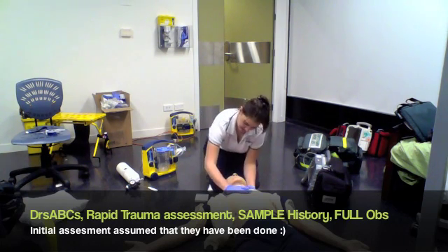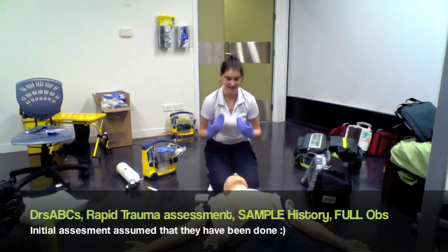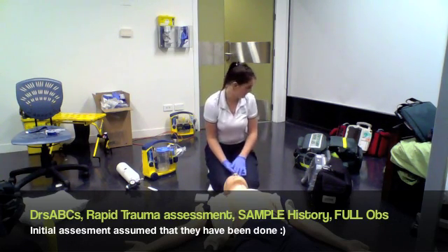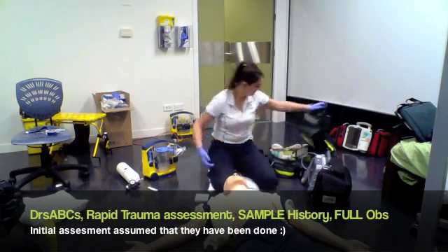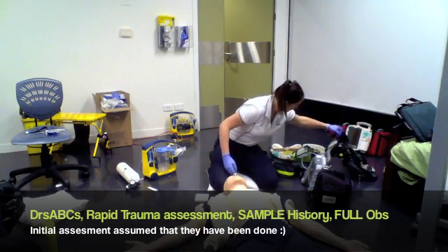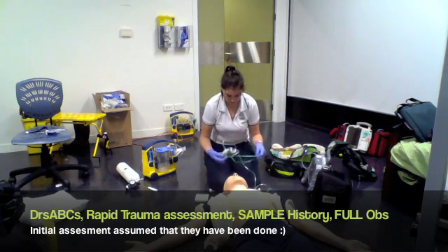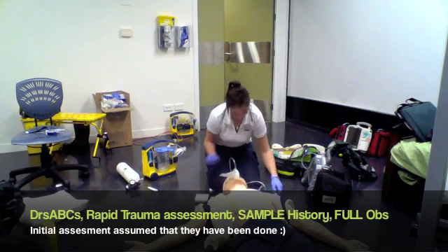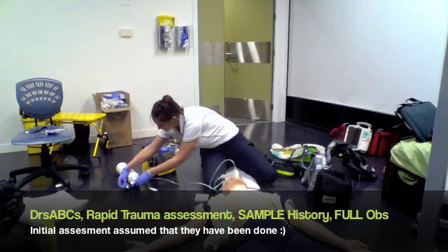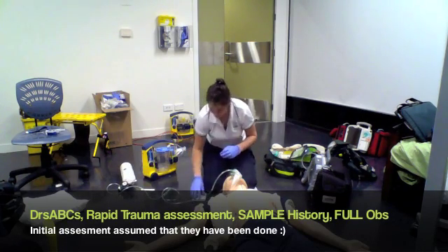His breathing, according to the scenario, he has a respiratory rate of 12 breaths per minute, but it is irregular. He's holding his breath and grunting, so I have some concerns about his breathing. I'll be wanting to get some oxygen on him. Because of this, I will be using a reservoir mask to begin with at a flow rate of 10 litres per minute. So I'm just going to attach it now. So we're going to assume that's running at 10 litres a minute on the oxygen bottle.